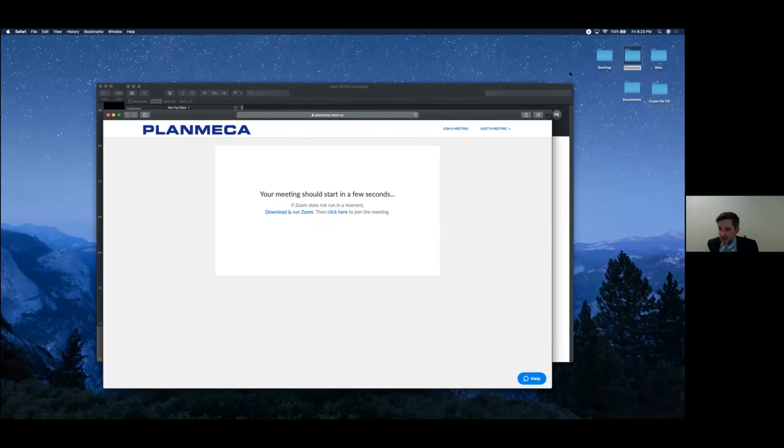I do not have the answer exactly for a 17 by 20 off the top of my head, but if you were to do ultra low dose for around that size, I would say probably 30 microsieverts or less would be my estimate, based on the size that you're giving me. So around 30 microsieverts for a large field of view like that. So less than 30.